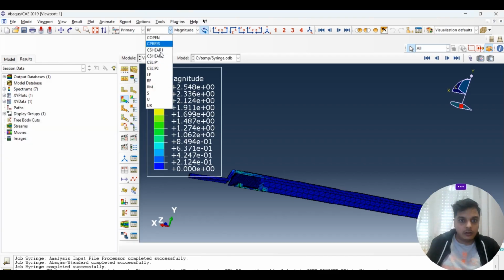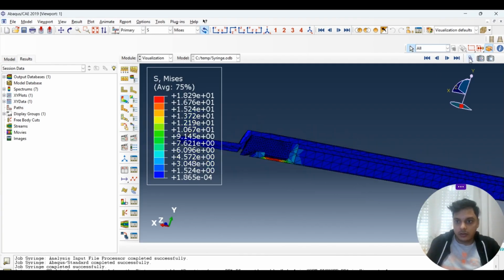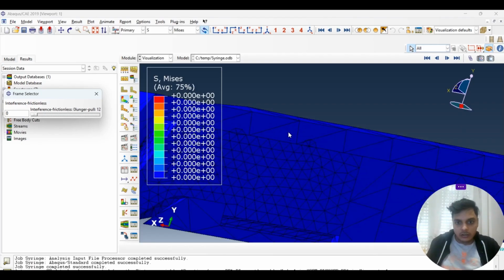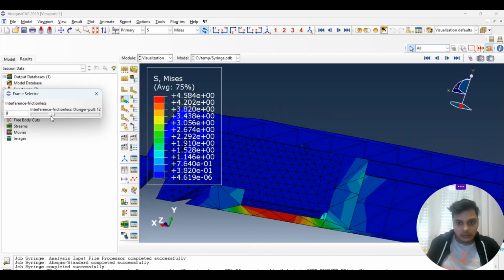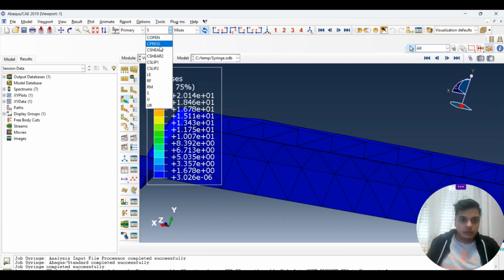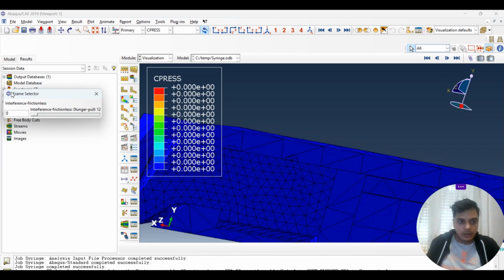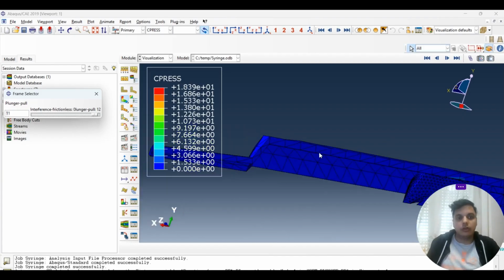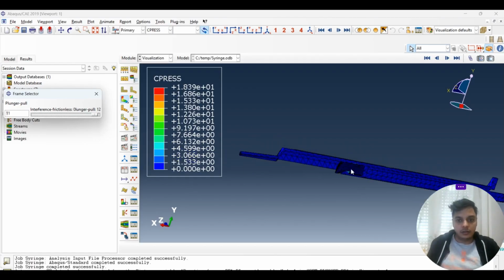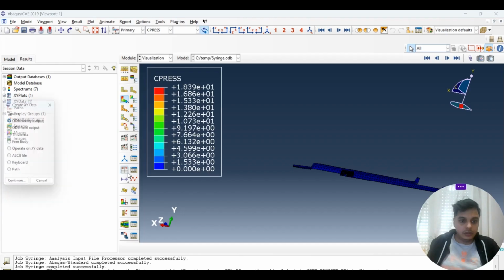Also if you want to check the von Mises stress, you can check where exactly the maximum stress was coming during the analysis. Initially there were no stresses, the frictionless, it tries to pull and then tries to push it backward. Also we can check the contact pressure for our rubber part, again here. It first compresses, there are no stresses, and then it goes on and on. So it totally depends on the requirement what exactly you have to do, and you can plot each and everything.